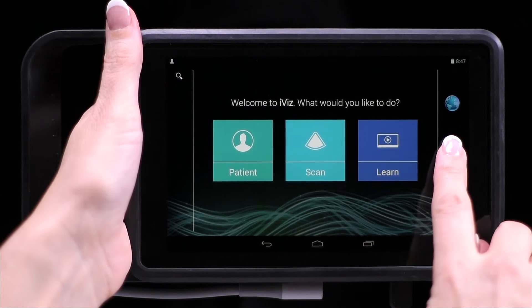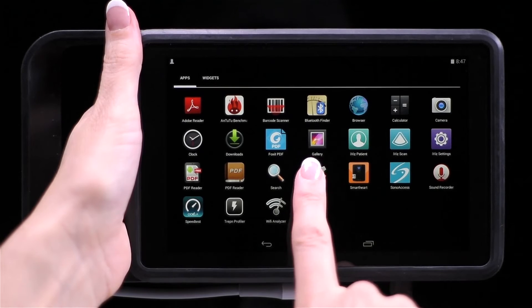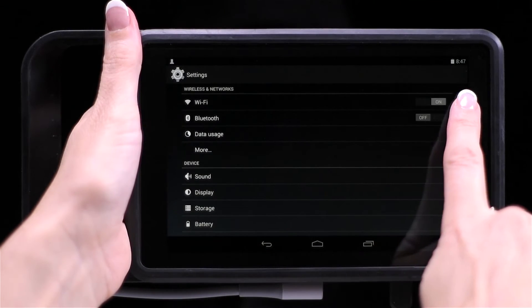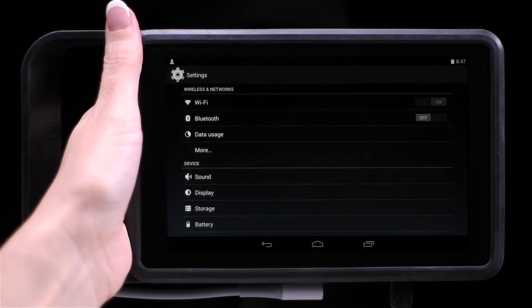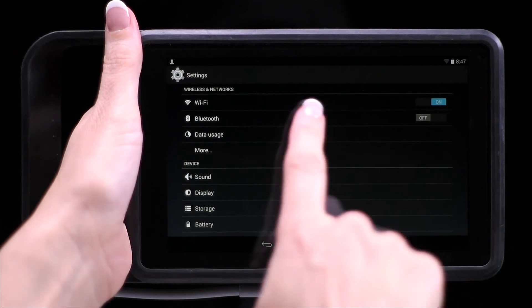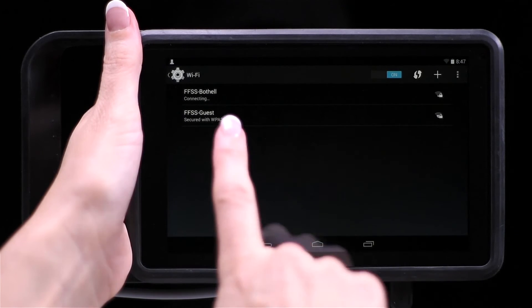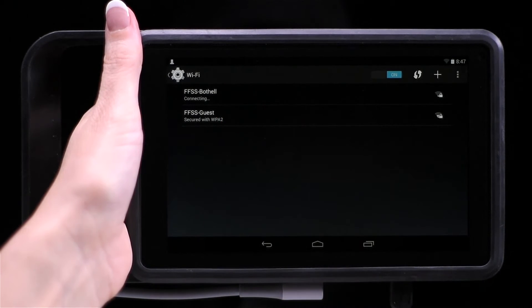To turn on Wi-Fi, from the home screen, tap the Android apps icon, tap the Android settings icon, and then slide the Wi-Fi button to on. Tap Wi-Fi to select a network and enter the password if one is required. Now you are connected.